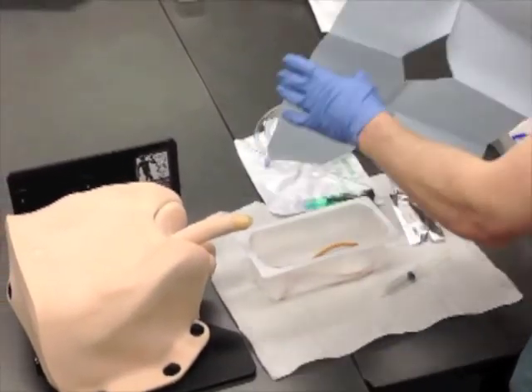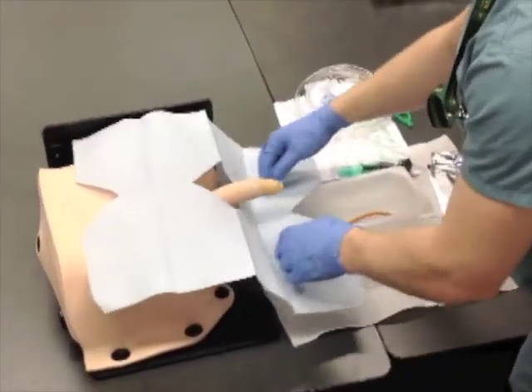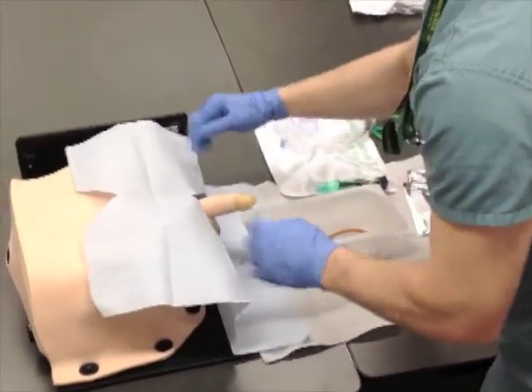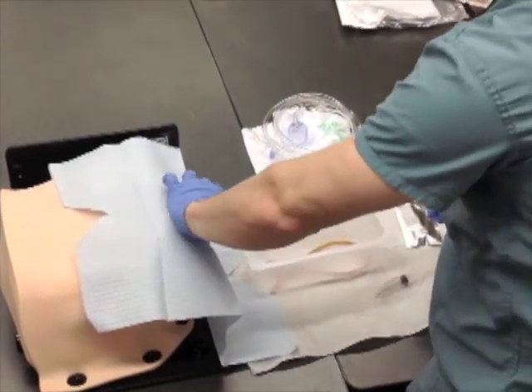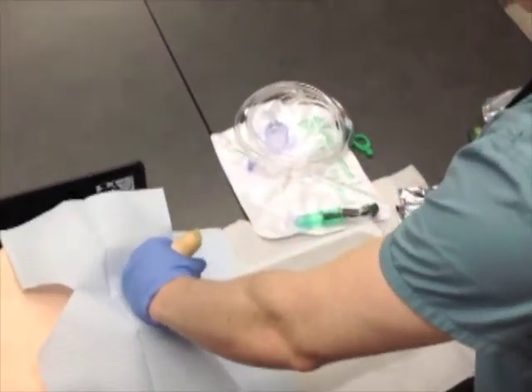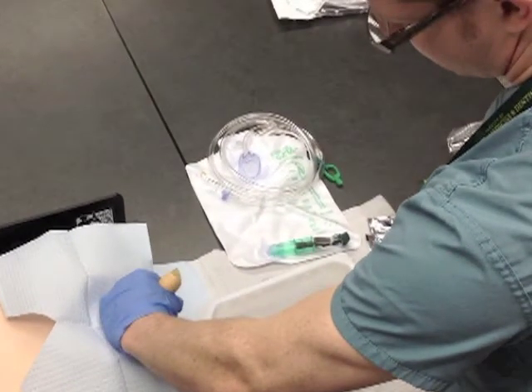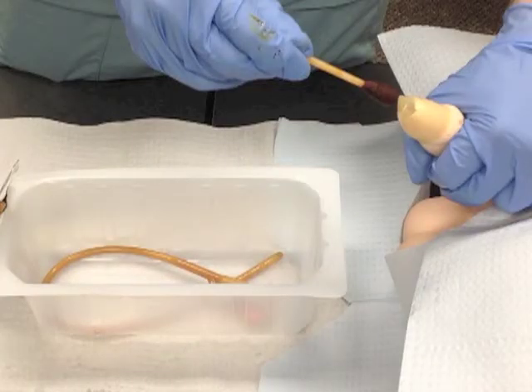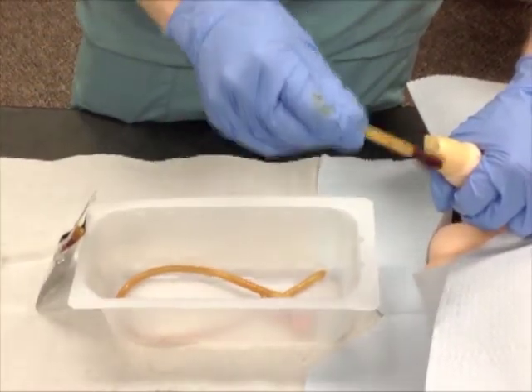Begin by draping the patient as shown, exposing either the vulva or penis through the drape's window. For males, take hold of the penis with your non-dominant hand with a firm but gentle grip and gently retract the foreskin. In females, your non-dominant hand will be used to spread the labia and expose the urethra. In either case, this hand is now considered dirty and will remain on the patient's genitalia for the remainder of the procedure. Using your dominant hand, prep the urethra with the betadine swabs, starting at the meatus and working your way out circumferentially. When 3 swabs total have been done, you're ready to insert the catheter.